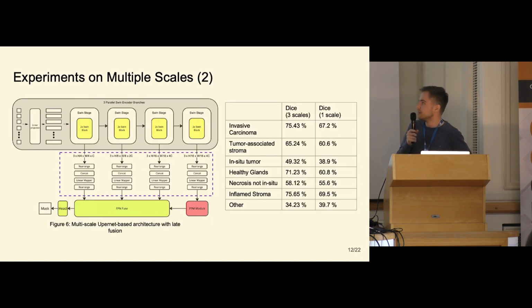We used three Swin encoders and combined features with linear layers and concatenation. On the right side, you can see the evaluation per class. We can see that performance was a little bit worse within the class other, but other is also a combination of several other classes that do not necessarily look the same.